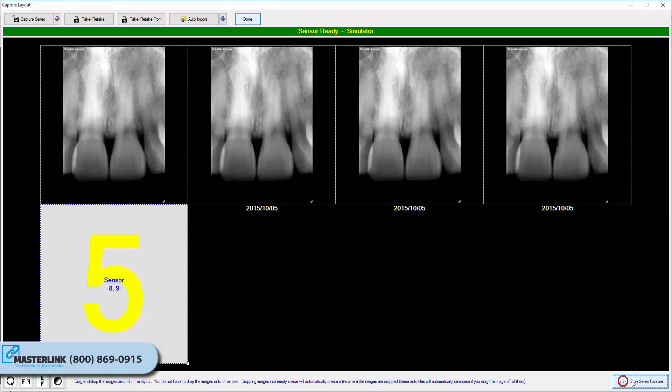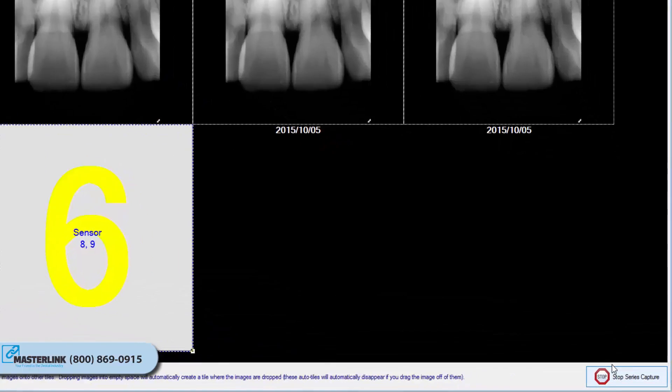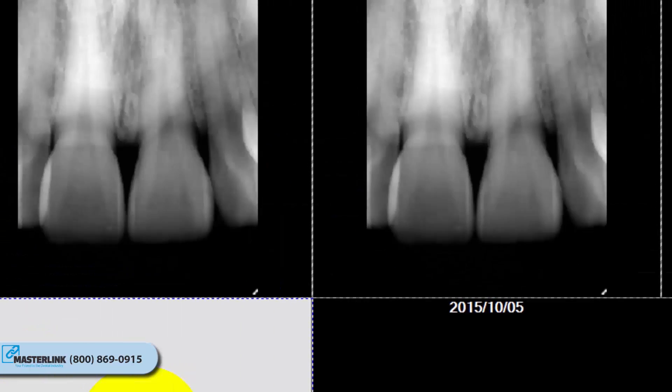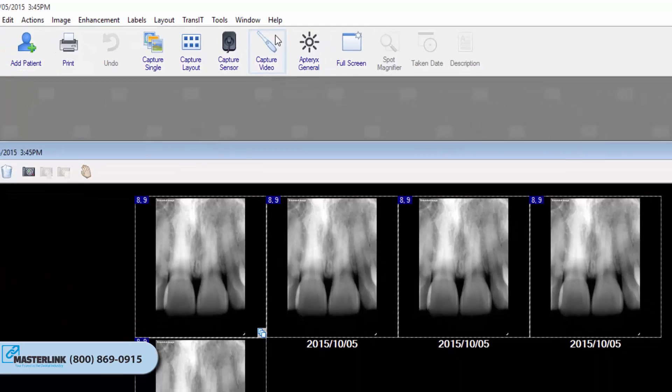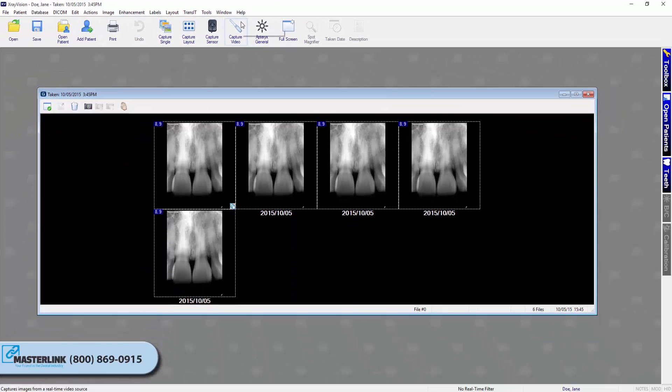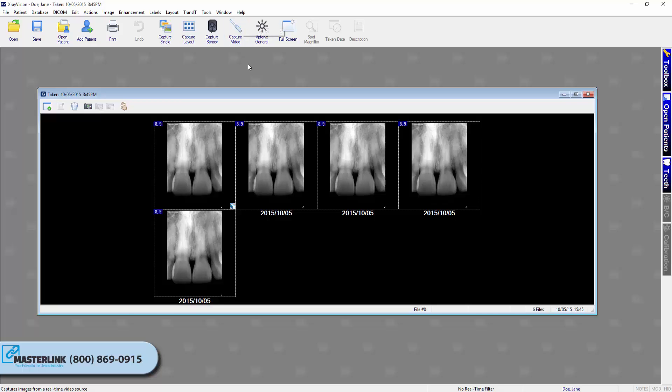Once you have finished capturing images, click on the Stop Series Capture button in the bottom right of the Capture Layout window. Then click on the Done button at the top of the window. For more information about retaking images and other interactions during Layout Capture, refer to our Interacting with Layouts video tutorial.